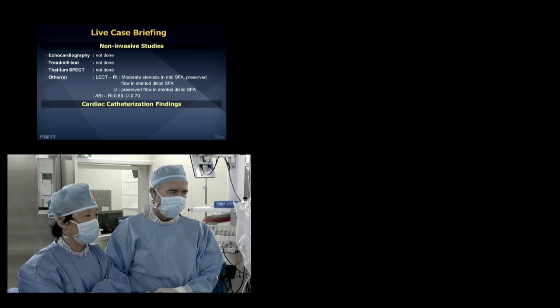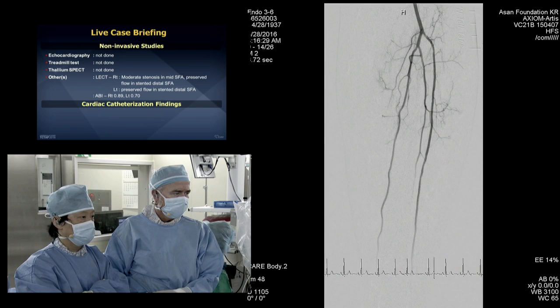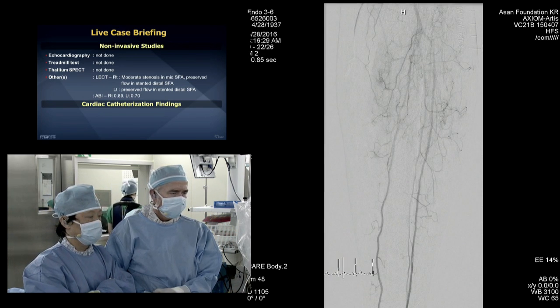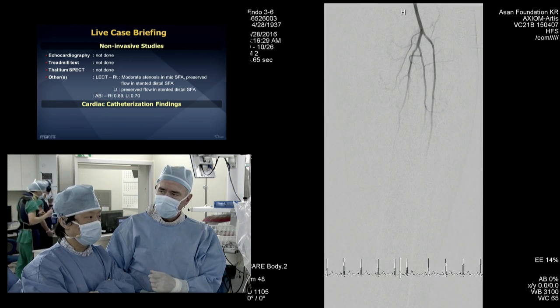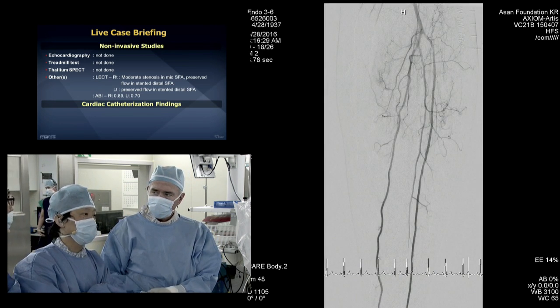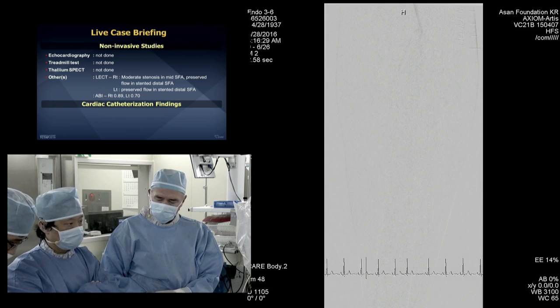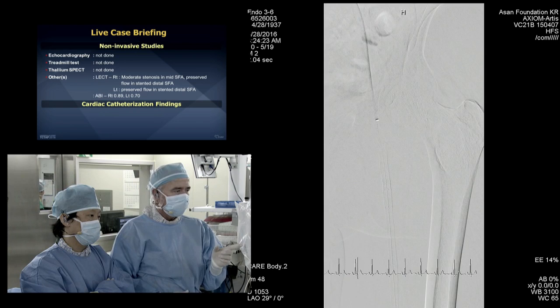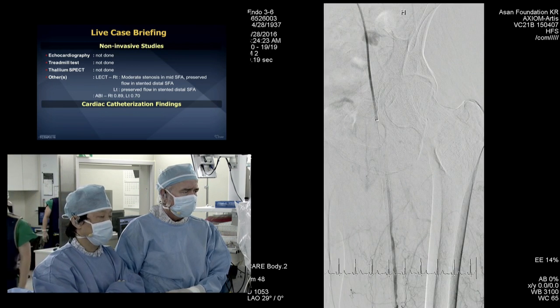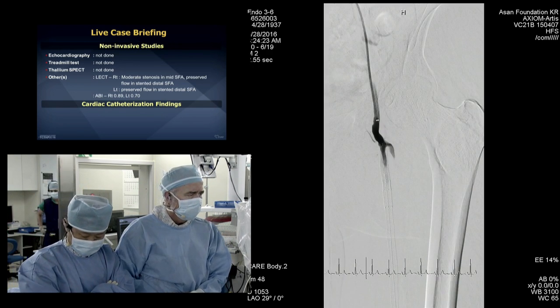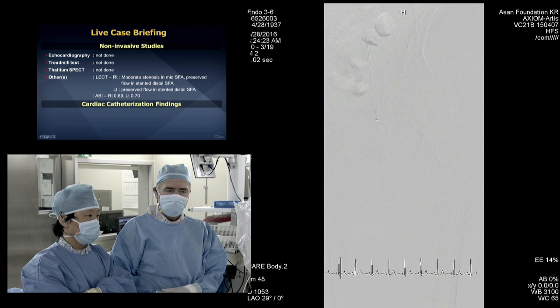There's a pretty nice runoff below knee, consistent with his 0.7 ABI. The stents are 6-millimeter diameter distally and 7-millimeter diameter more proximally — self-expanding, specifically a Smart Control and Life Stent. On the oblique view, the stent stands up and just barely crosses the origin of the profunda, probably a couple millimeters more proximal than ideal, but the profunda stayed open, so it's not a clinical problem.